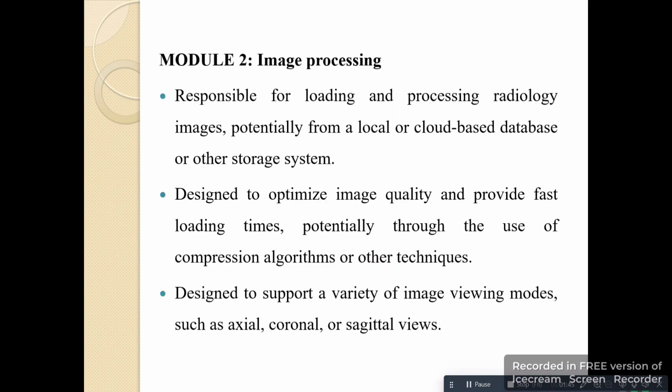Module 2, image processing, responsible for loading and processing radiology images, potentially from the local or cloud-based database or other storage system. Designed to optimize image quality and provide fast loading time, potentially through the use of compression algorithms or other techniques.